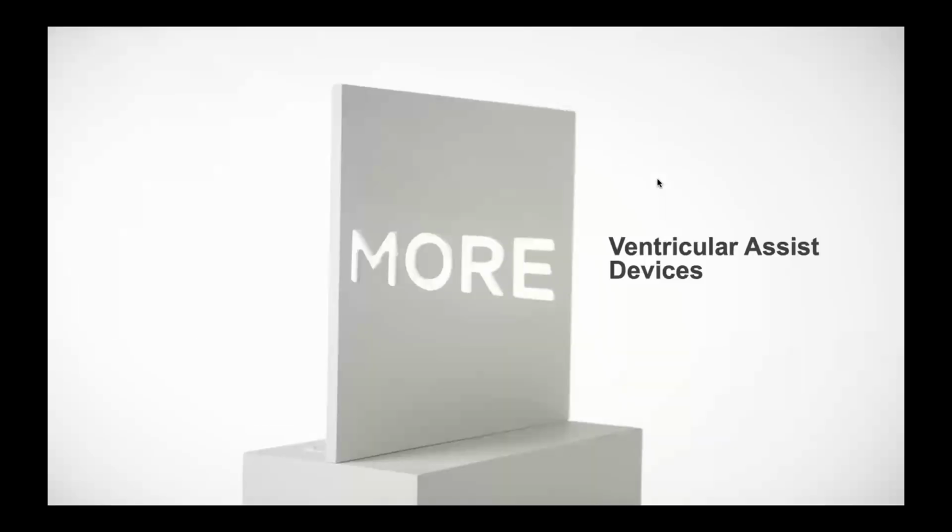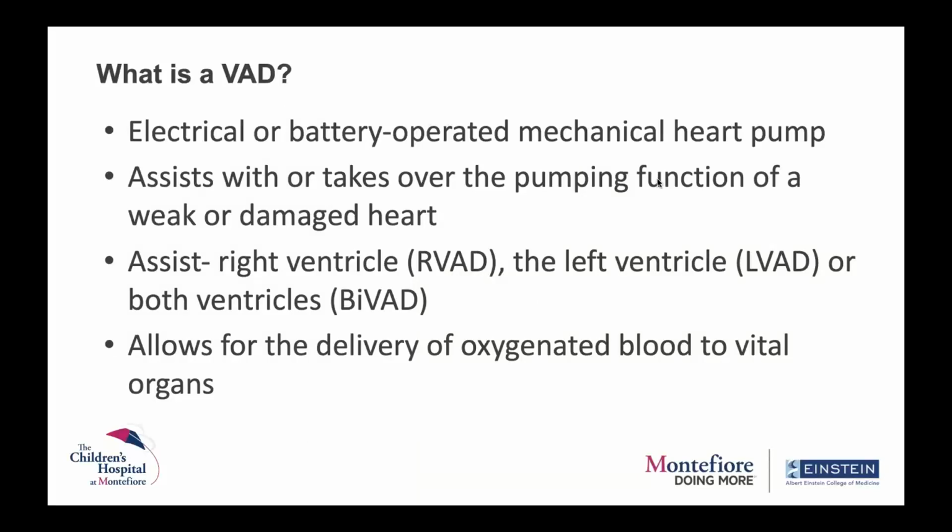So let's talk about ventricular assist devices. What is a ventricular assist device? So these are electrical or battery operated mechanical heart pumps. Sometimes it assists and sometimes it completely takes over the pumping function of a weak or a damaged heart.